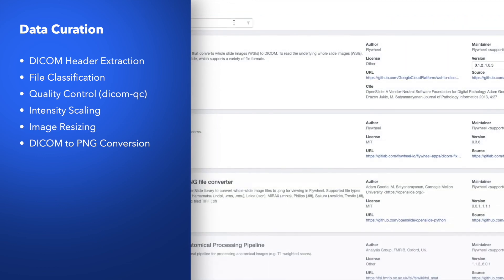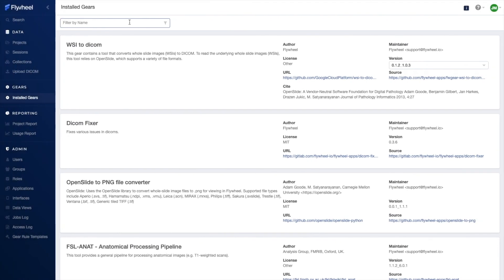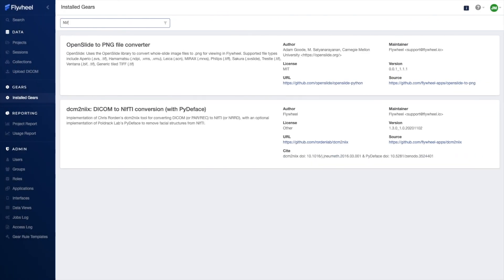And because gears are containerized and version controlled, running this set of gears on different Flywheel sites will yield consistent results.